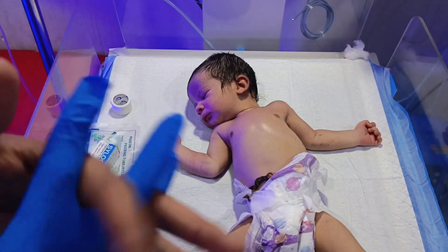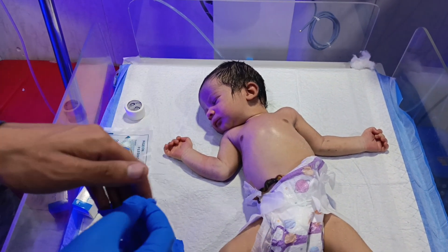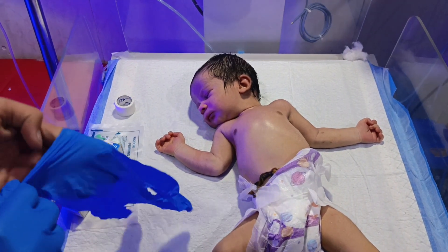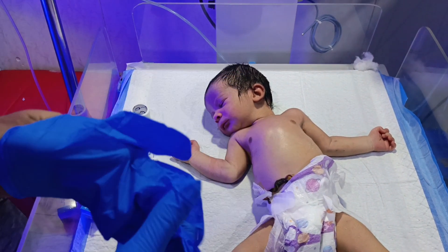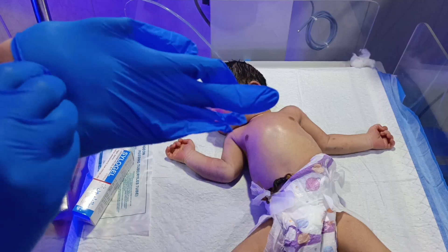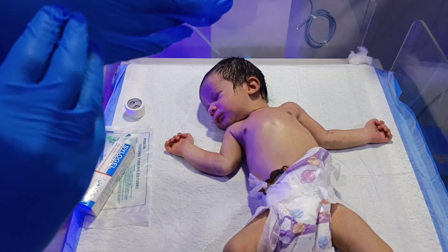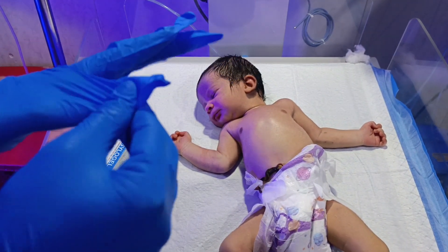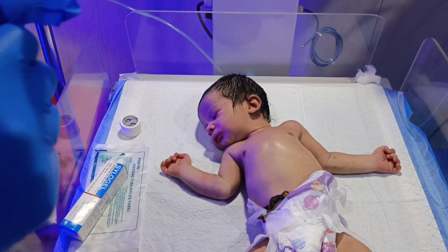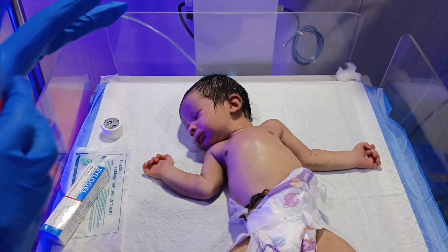Hi, hello viewers, how are you? I hope all is good. Welcome to my YouTube channel. This is a new baby with the diagnosis of [unclear condition], with continuous seizures. We are here with the baby on YouTube to show the procedure of NG tube — how to pass an NG tube for newborn babies.